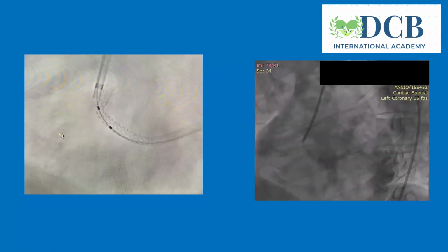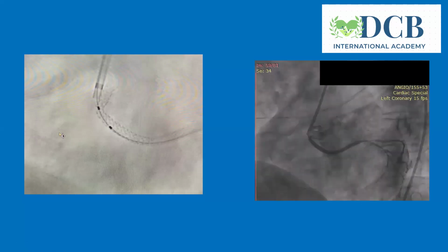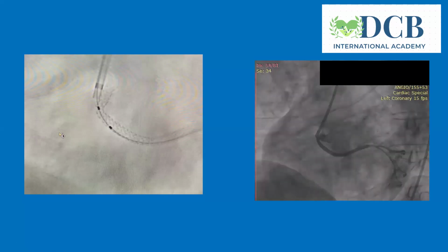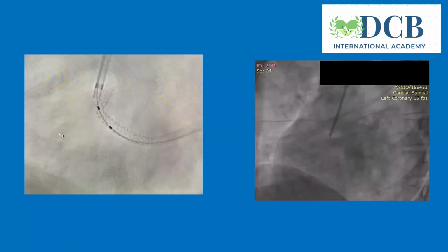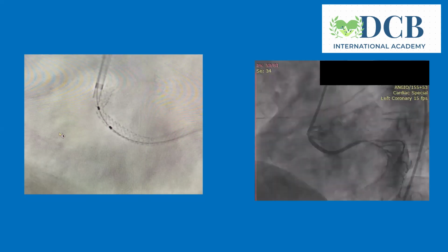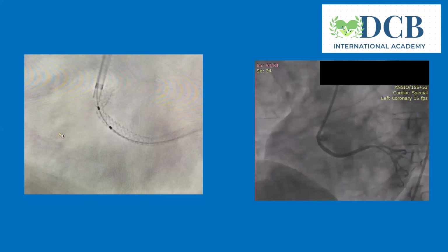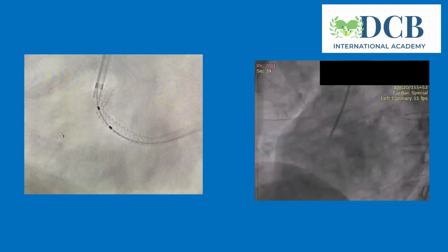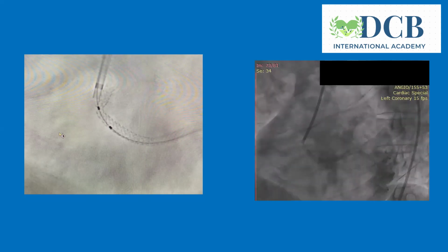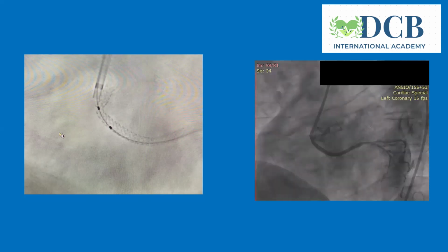It depends how much back you've come into the aorta, I guess. If you are sort of 3-4 millimeters back, then it's a bit tricky. But one thing you can do is remove the balloon, back the guide out a bit, and then try and see if you can rewire, and then pass an IVUS down and make sure you're intraluminal. It's tricky because there's quite a bit of stent.